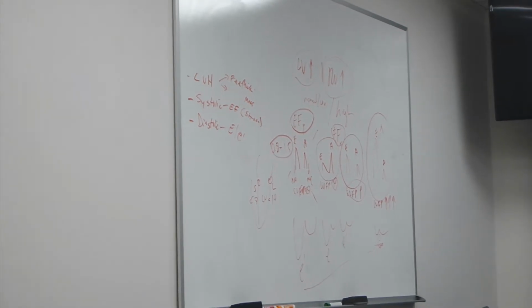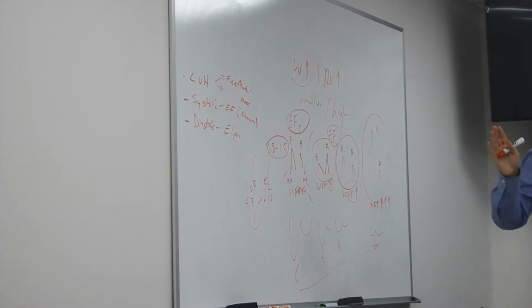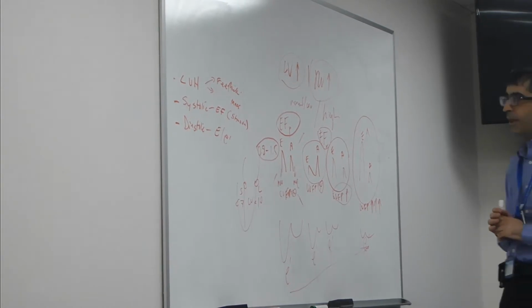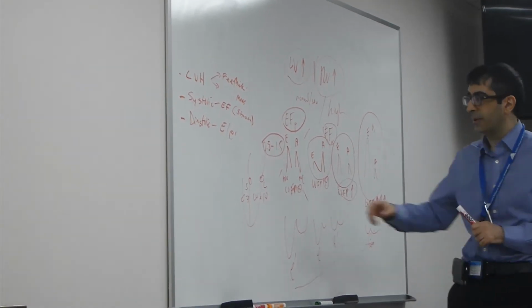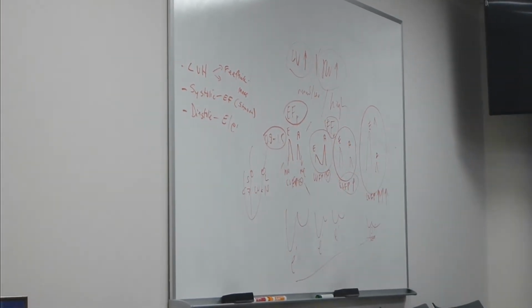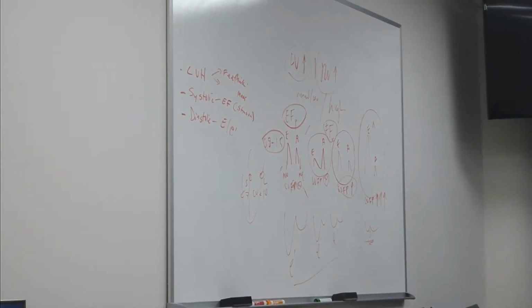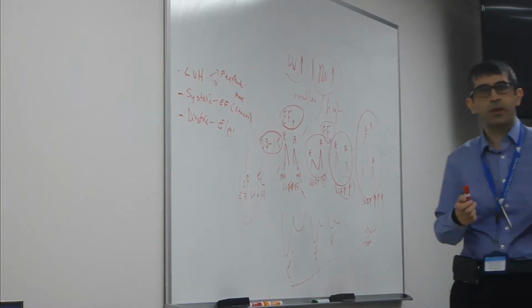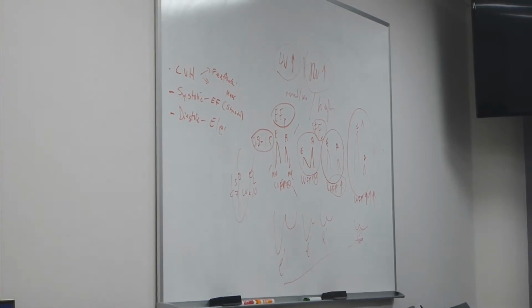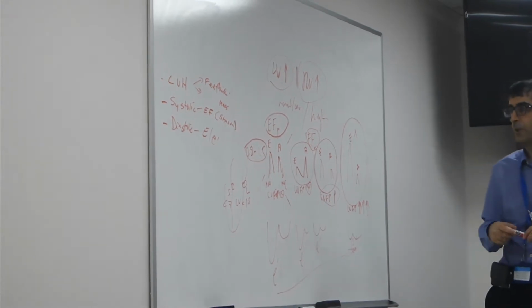That's why, if you look at the guidelines, they do not suggest using a single measure like the E to E prime ratio. They suggest using other things, like LA enlargement. A large LA supports the notion that your filling pressures are high and they have diastolic dysfunction. In the emergency room and in general, it's very tough to measure the LA volume index because it's a tedious process. You have to open the atrium. It's tough even for a tech. Forget about it in the acute setting.